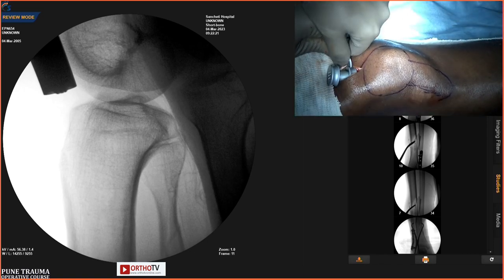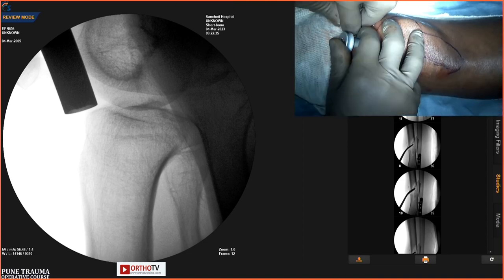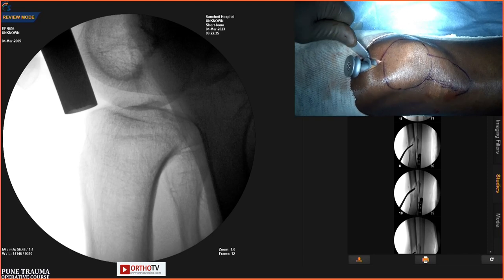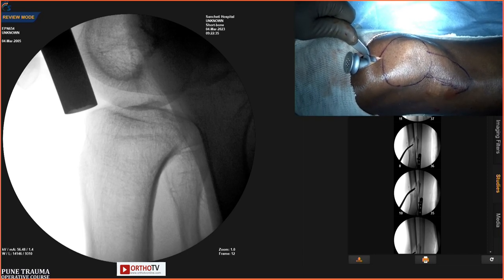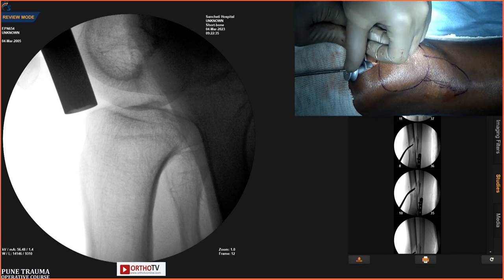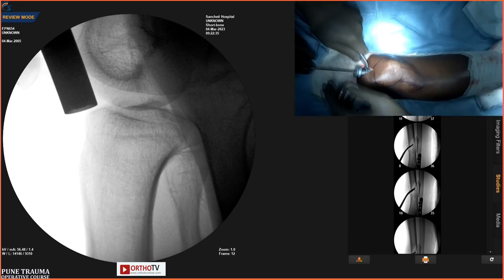And then he will pass a guide wire. Preferably the majority of the time I put a solid reamer, what we can say a perforator, guide wire there, sister. Sir, guide wire. It will slide here and there. Small guide wire.